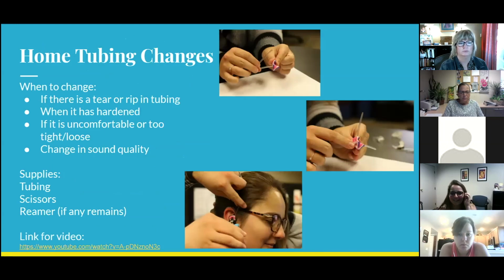The next thing, kind of relating to that, is I'm sure that a lot of you had tubing changes back in the day. That was the big thing, but I know especially with everything going on with COVID right now, trying to make as much possible at home for you all is important. So home tubing is definitely a possibility. Things to look for on when you would change it: usually if there's a tear or rip in the tubing, so that might be creating some sort of feedback, when it's hardened and it can be uncomfortable, if it becomes too tight or too loose, or if your children know that maybe there's a change in the sound quality that they're getting.